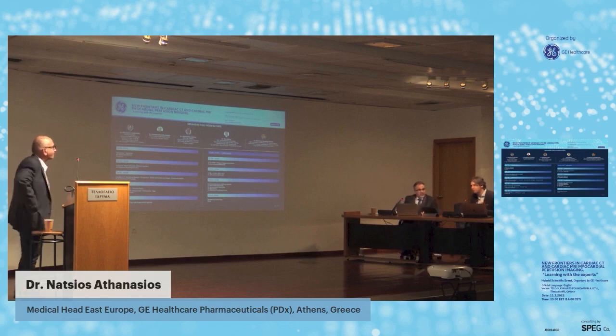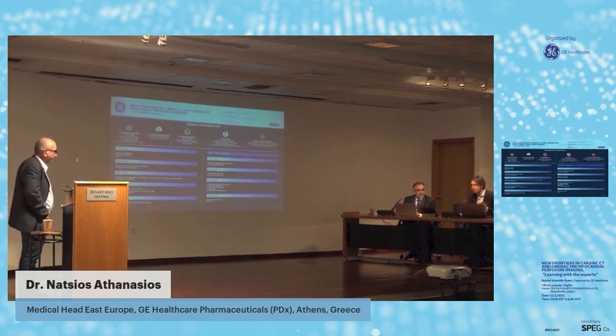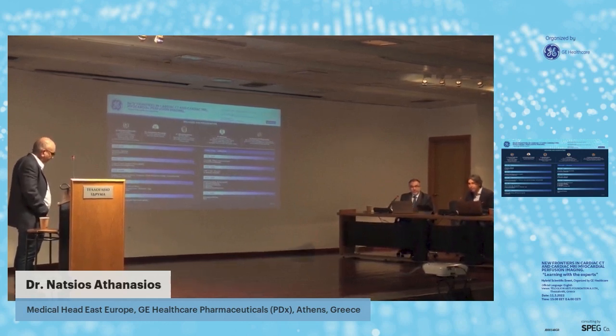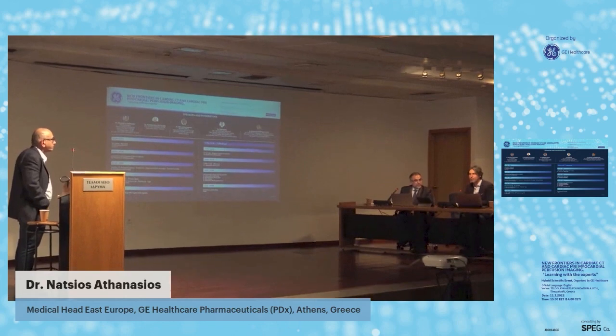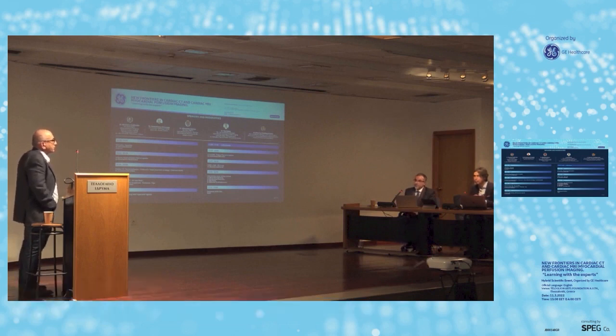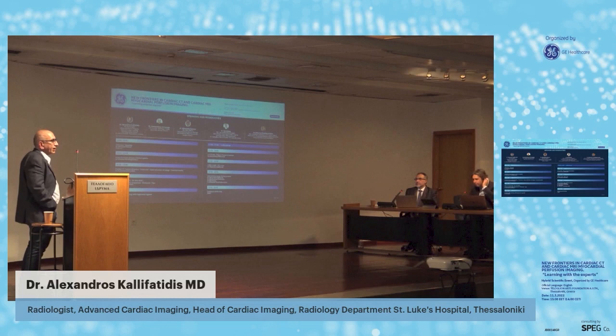I think that the message, Kostas, from this final case could be that although we have a young patient, asymptomatic, but high risk due to the family history, and with calcium score of 0, we have to proceed to CTA. Exactly. Because we saw this impressive plaque, valuable information that we cannot get with other techniques. Exactly. I have to make this point too, that these two last cases were CAD-RADS 1V.